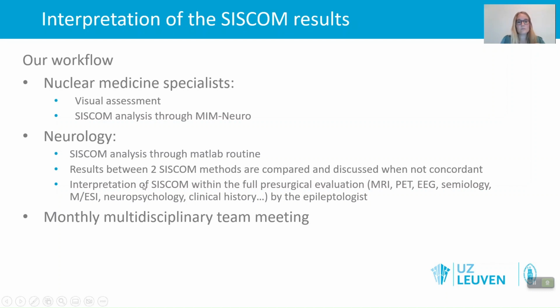Then the SISCOM image has to be interpreted within the full pre-surgical evaluation. So this means, depending on the modalities you use in your center, it's the MRI, the PET, EEG, semiology, the MEG or the electric source imaging, neuropsychology, clinical history, all of this together.